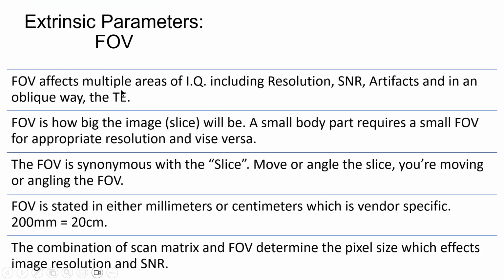Have any of you, when you're scanning, dropped your field of view a little bit, or even a lot? Suppose you go from 300 field of view down to, I don't know, 180. I'm just throwing out numbers. Maybe you get a little pop-up that says, hey, I've got to up your TE by 2 milliseconds, and you check and just go, yes, dear, and continue. Have you gotten that pop-up before? You don't have to answer me. But if you have, that's because your field of view is affecting your TE.